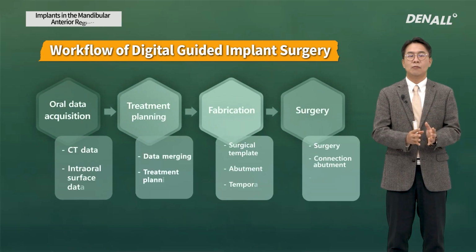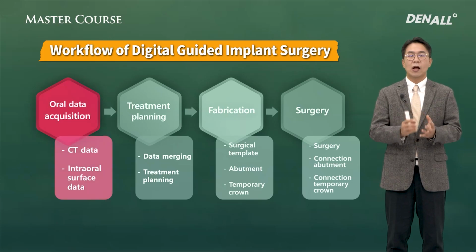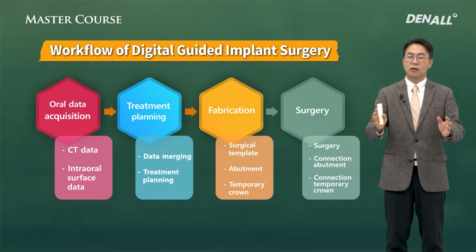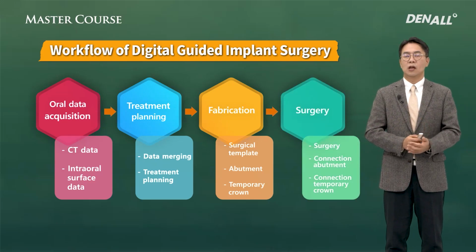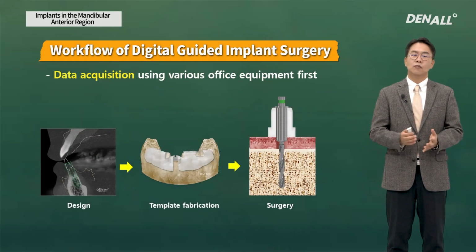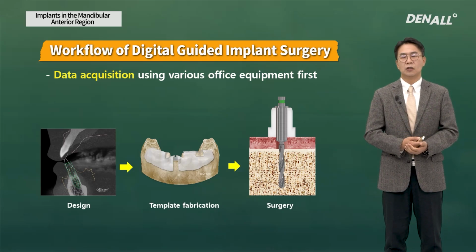Before the surgery, we need preparation in the digital guided implant surgery. As I said before, we need to acquire patient data. Based on that, treatment should be planned. The treatment plan should be reflected in the template for the guided surgery. If you use it, you can do the surgery in a safe and fast way. There are steps to take, and if you are not used to those steps, it may take some time to get used to it.